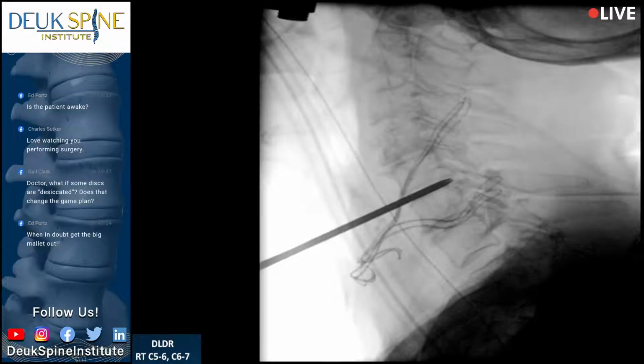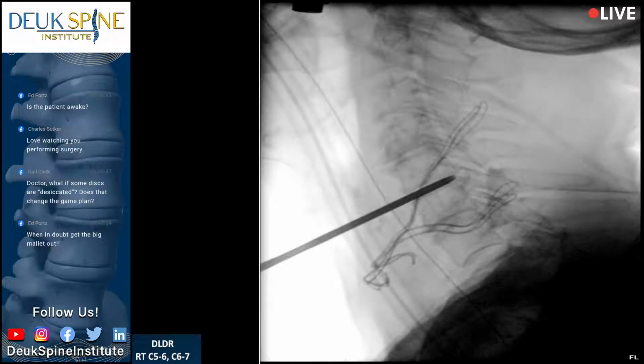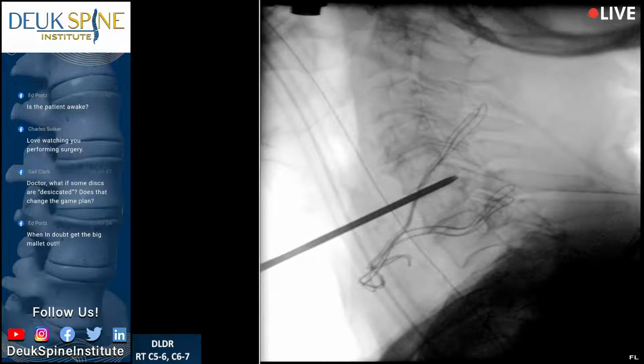I don't think so. Okay. We're already back. I think we're a little bit off on orbit. But no, I think we're good. So you can see the dilator has spread open the bones. I think I want to go a little further. Shot. All right, that's good.